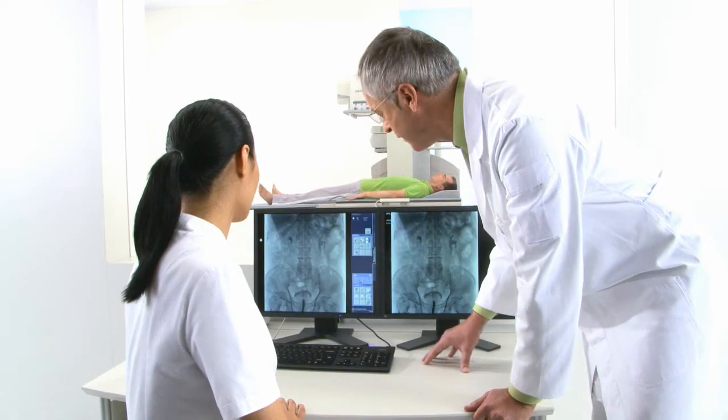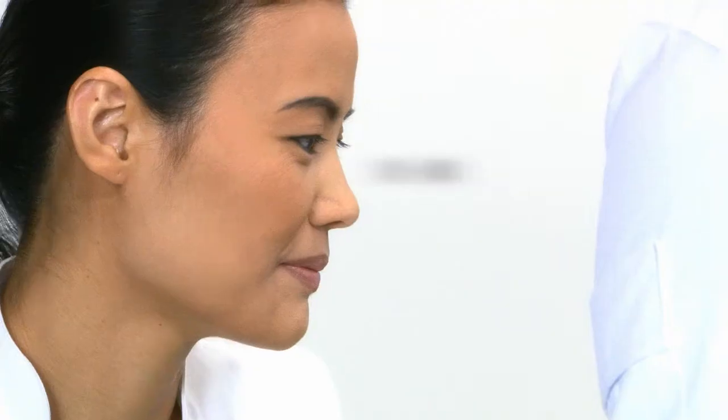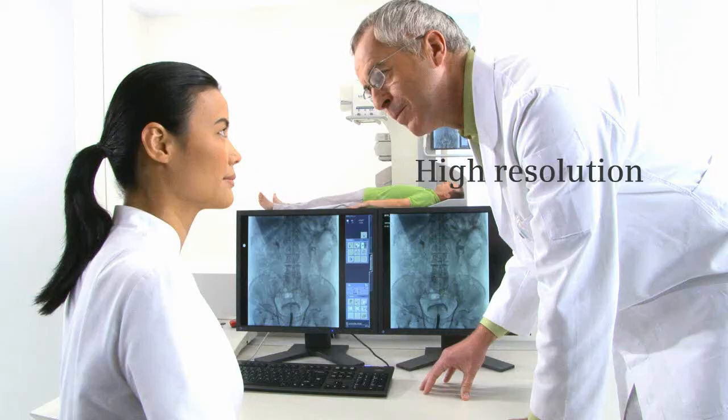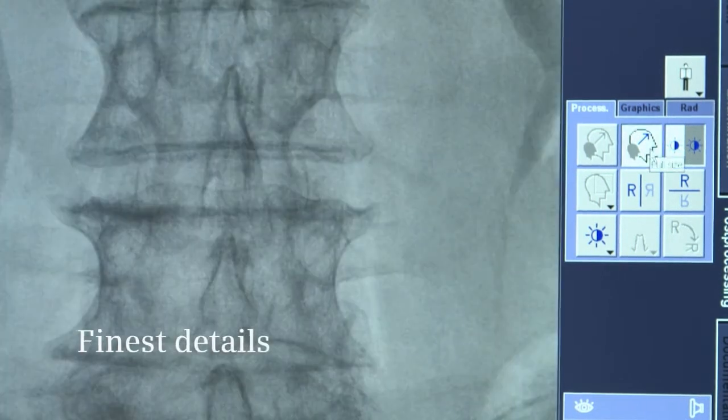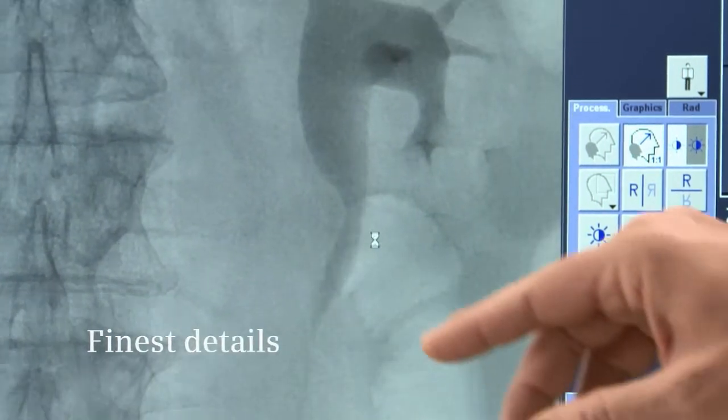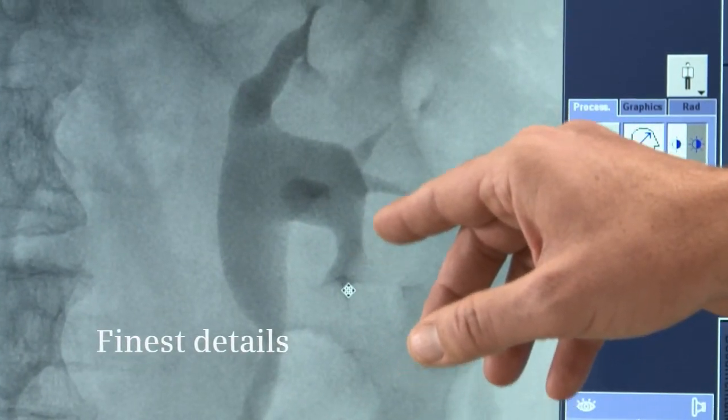With more than 2800 by 2800 pixels, the resolution of Euroscope Omnia exceeds that of standard image intensifier systems. You can see the finest details with unsurpassed, distortion-free image quality.